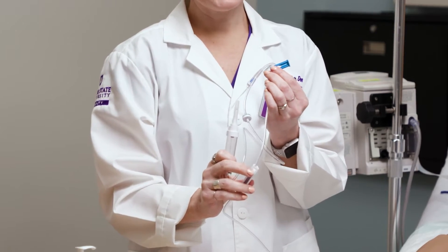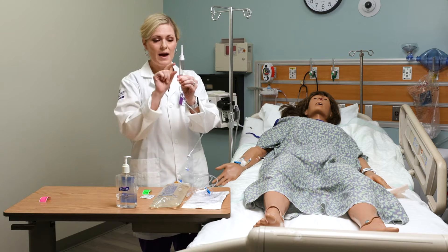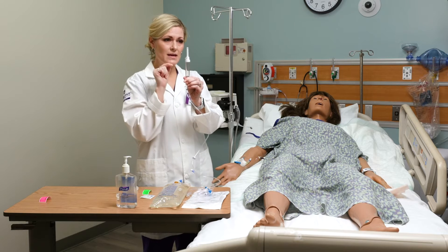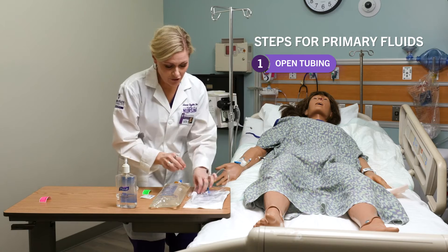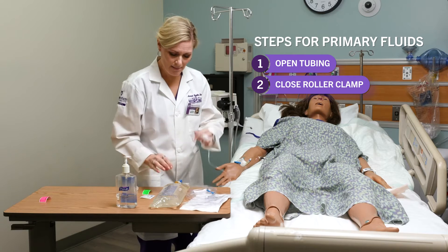The roller clamp is what we're going to use to adjust the drip rate. This is our drip chamber — when I spike the bag, we're going to fill that halfway. We want to make sure to leave some room in the top so we can see the actual drip rate going. This is our spike; you'll notice it's covered with a little cap. We're going to keep that in place until we actually spike the bag. First I'm going to clamp my roller clamp closed before I spike my bag.